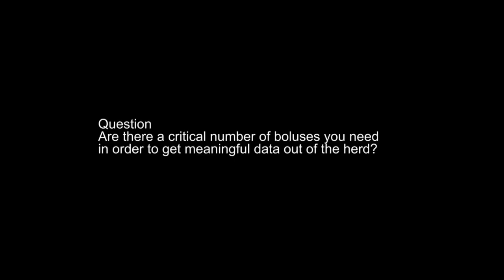Okay, and is there a critical number of boluses that you need to ensure that you get meaningful data off the herd? That's the $64,000 question, and of course eCow would like to sell as many boluses as possible, but we're still working towards what the optimum number is. We say about 4% is about right. One in 30 cows, 1 in 25 cows.